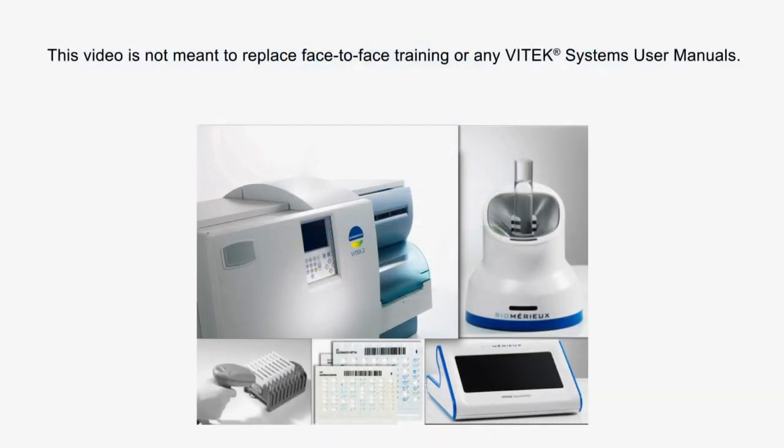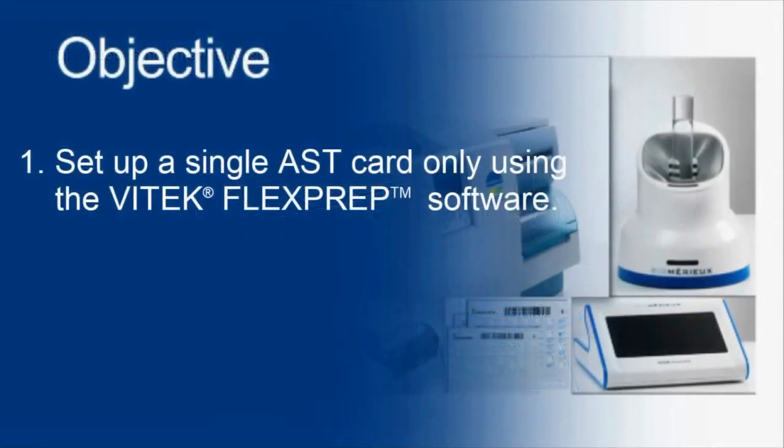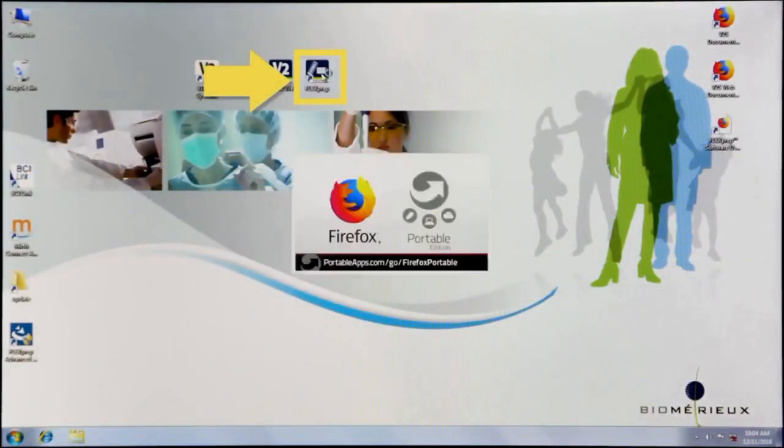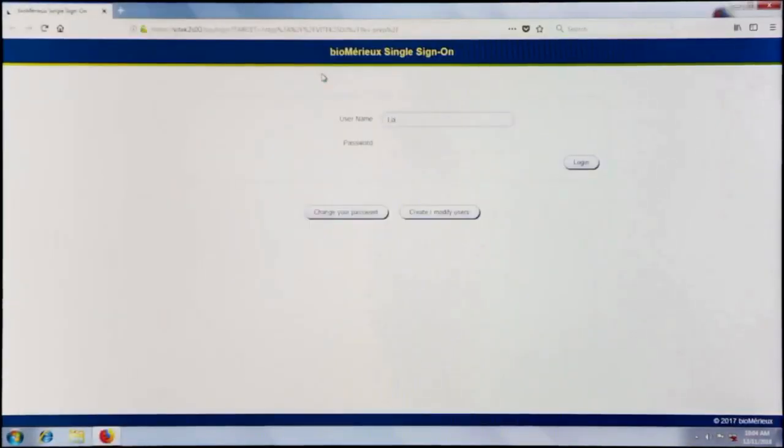This video is not meant to replace any Vitec systems user manuals. Double-click the FlexPrep icon located on the computer desktop and log in.